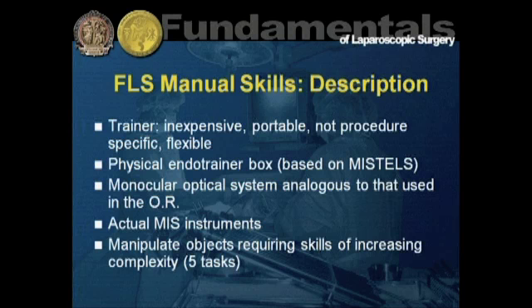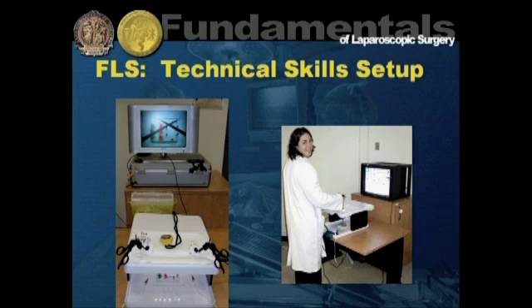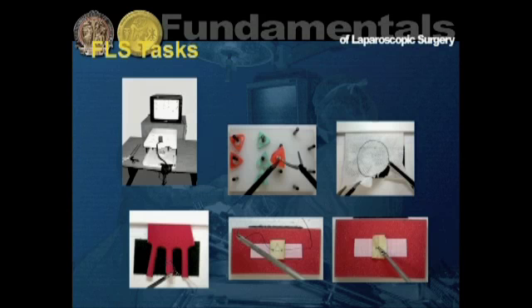So ultimately we came up with 5 tasks, and we'll go through those tasks. There's Melina there demonstrating those tasks on the right at a younger age, but still doing them expertly. So the idea is that we're working in a box trainer environment. We have a camera that provides a monocular system image that displays on a monitor. You could use any monitor that you have available to you. The cover of the box is opaque, and so therefore only through the monitor can you see what's going on inside the box, just like the real world environment. Just different versions of the setup, and it's evolved over time. And these are the 5 tasks, and I'll take you through them one by one.